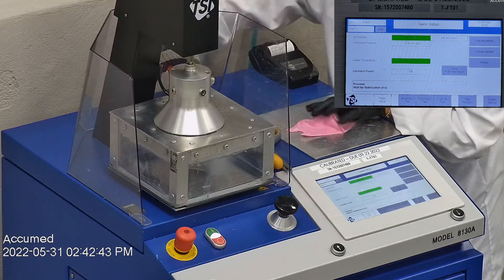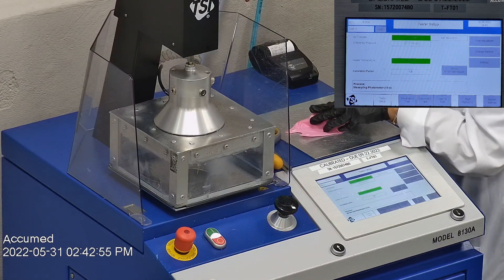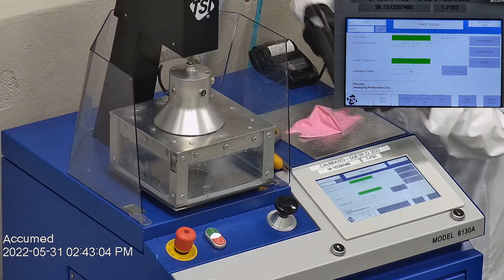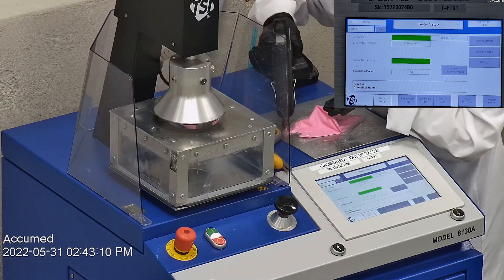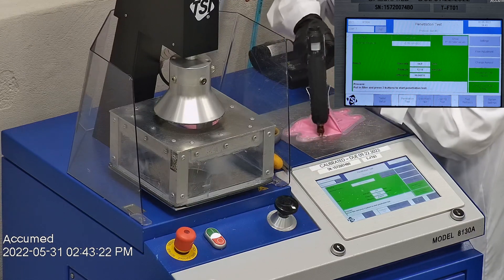Then we make sure that the mask is properly and completely sealed with hot glue to the testing plate. When applying the hot melt glue, we make sure there are no holes or leakage around the seal to ensure accurate results. The testing plate is attached to the frame and the box is placed under the TSI filter holder for testing.